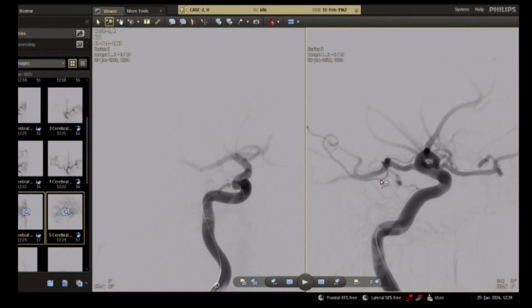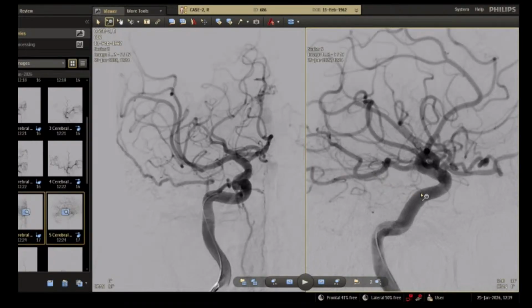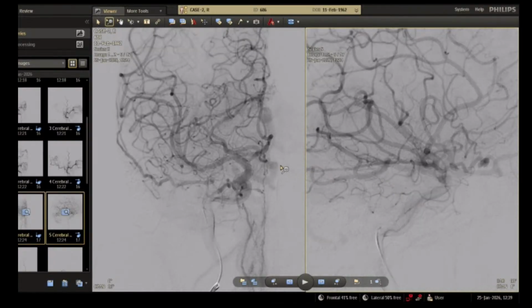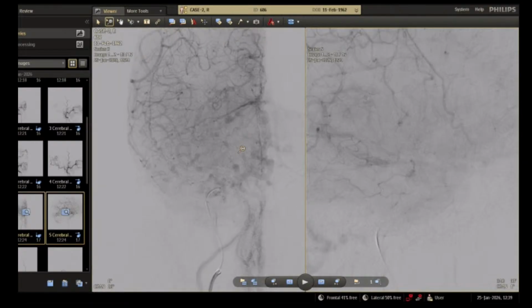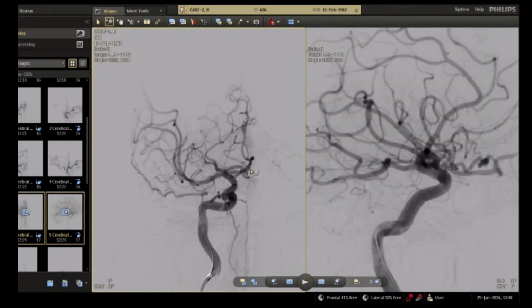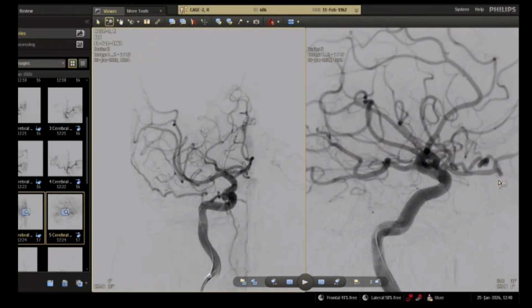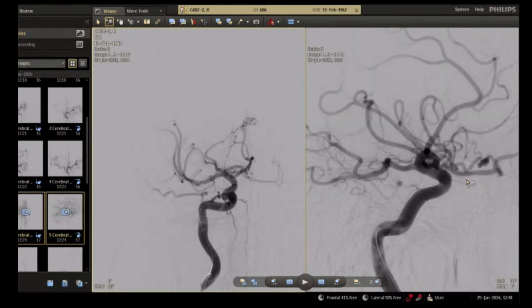If it's necessary, we can go from the ophthalmic, but it would be the last plan, because the ophthalmic artery usually might be risky because of the retinal artery damage. Okay, let's try to do it more safely.